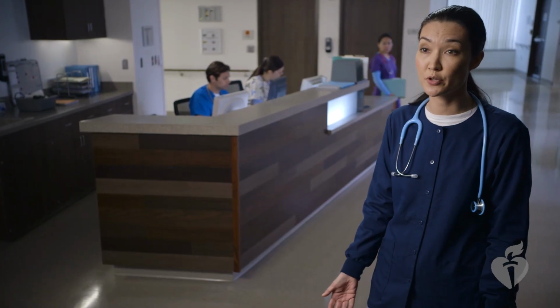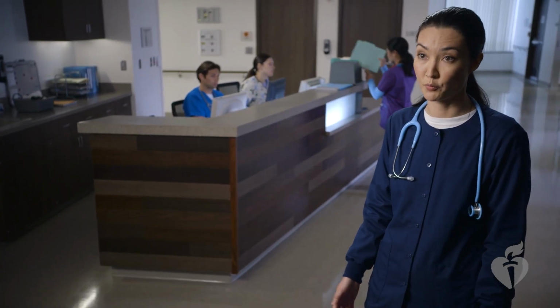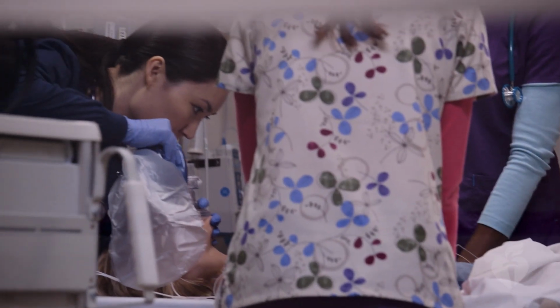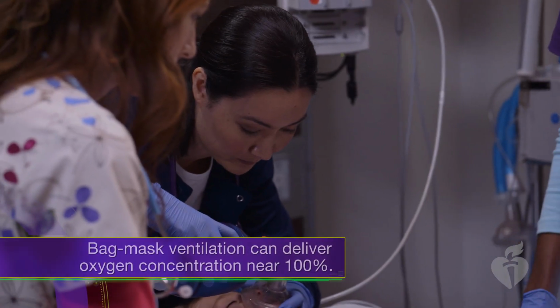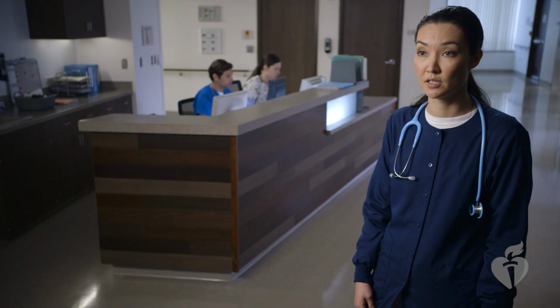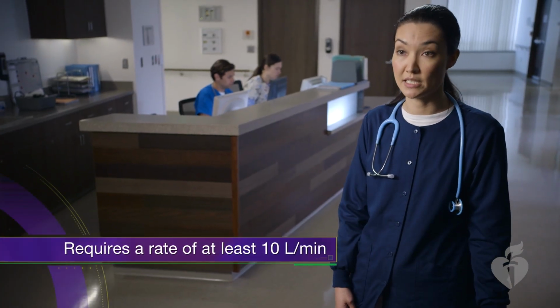In the most serious respiratory emergencies, effective ventilation may require positive pressure. In these circumstances, the use of a bag mask device is the most important life-saving skill you can perform. Bag mask ventilation using a bag with an oxygen reservoir can deliver an oxygen concentration near 100%. This requires an oxygen flow rate of at least 10 liters per minute. When properly performed, bag mask ventilation can be as effective as ventilation through an endotracheal tube for short periods of time. When bag mask ventilation is needed, healthcare providers must be ready to perform 2 other interventions: suctioning the airway and inserting an oral airway.